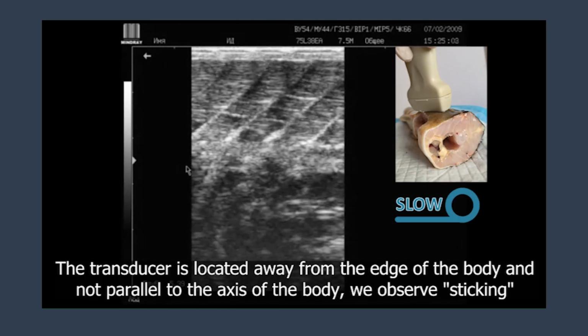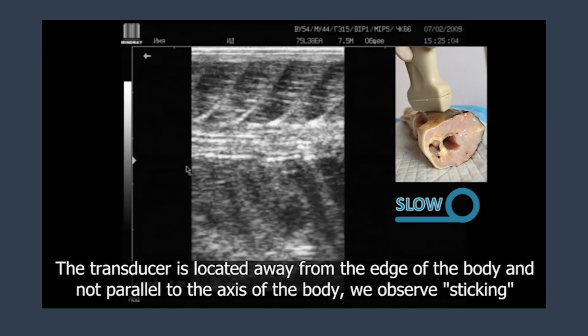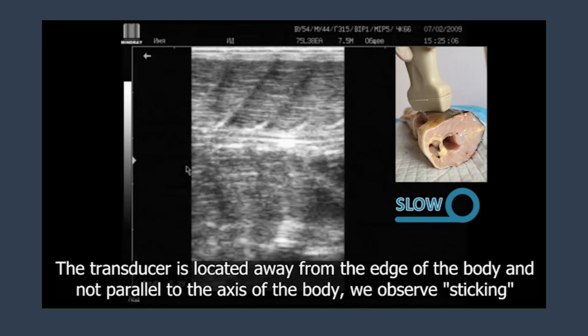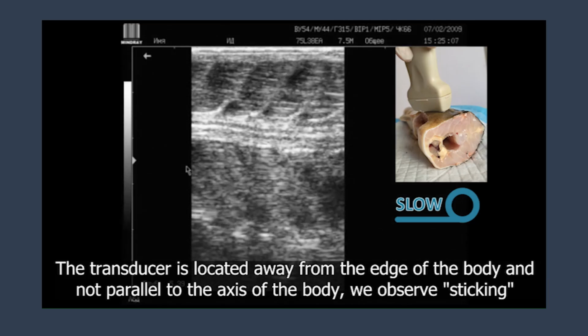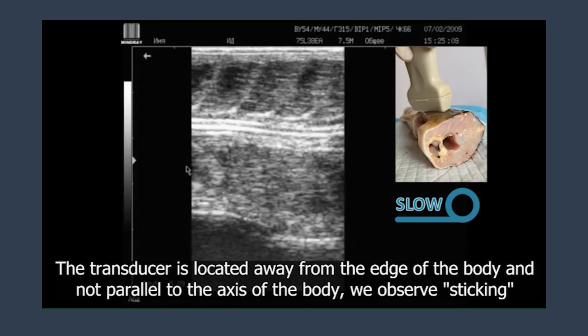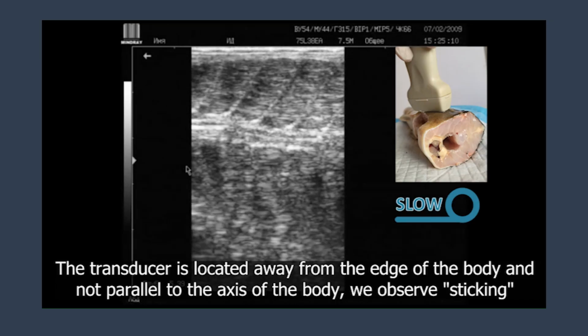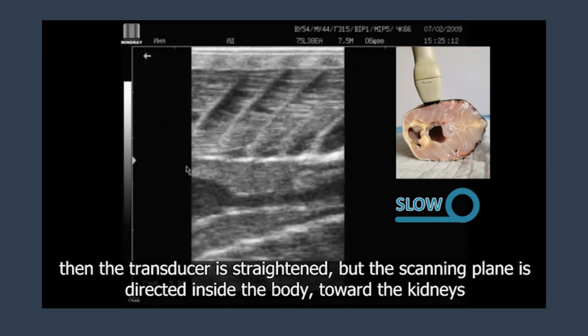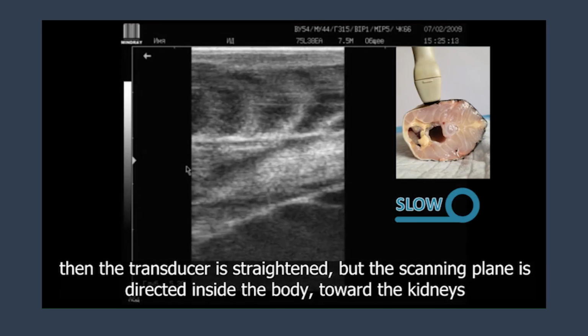Another possible mistake is skewing the transducer relative to the body axis. The picture on the right shows a slightly exaggerated version of this positioning, to give an idea of what we are talking about. In this case we observe a kind of adhesion of internal organs and practically only muscles are visualized on the sonogram. Changing the angle of the transducer in this case also does not improve the situation.